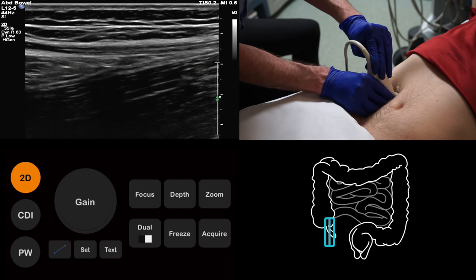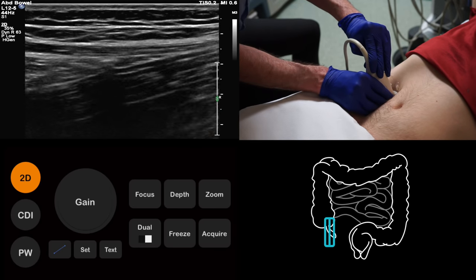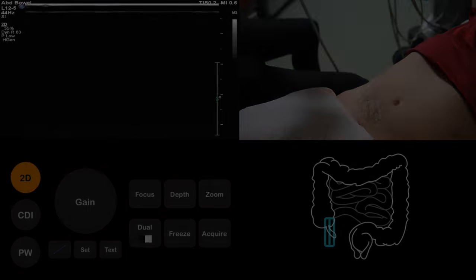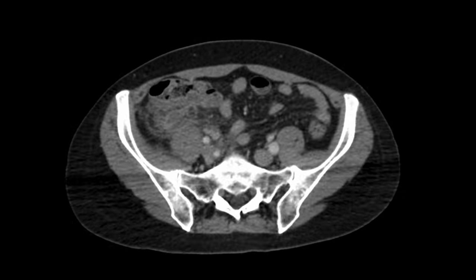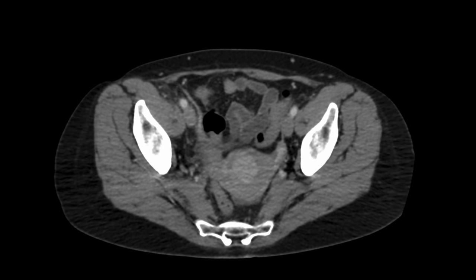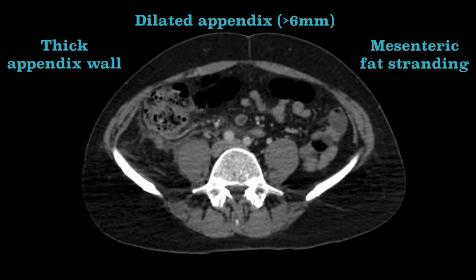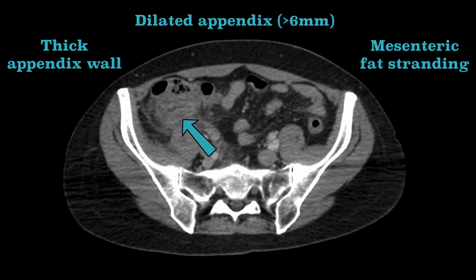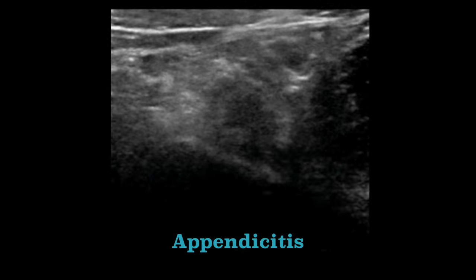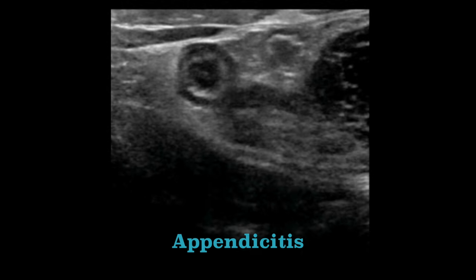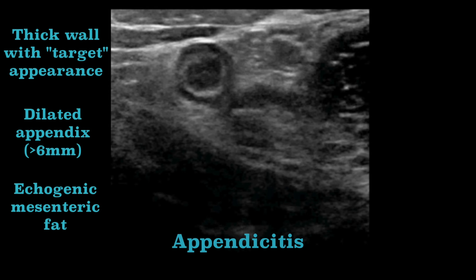Having gone through a strategy for scanning the appendix, we should now talk about the ultrasound appearances of appendicitis. It is useful to review the CT appearances of appendicitis, as there are some important similarities. In this example of appendicitis, we can see a thick-walled, dilated appendix with surrounding fat stranding. We can actually see the same things with ultrasound. In this example, we have the thick-walled, dilated appendix, just as we saw on CT. We can also see evidence of the fat stranding seen on CT, as the mesenteric fat appears diffusely echogenic.